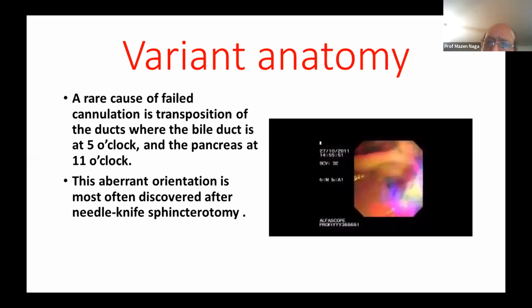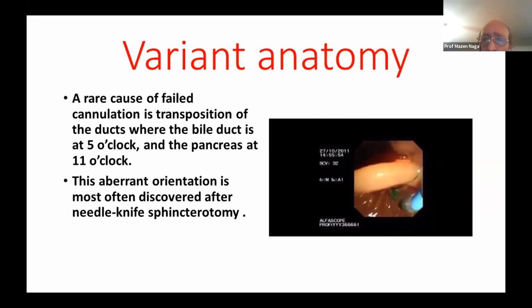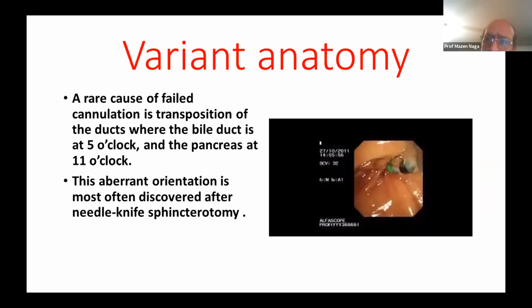We tried first with the sphincterotome with bowing and unbowing, but we failed. Then we shifted to the Soehendra 6 French dilator, trying to get into proper position, but also it was not possible. And after several tries, unfortunately, there is some deformation of the papilla with edema, making the shape of the papilla a little bit ugly. So now we shifted to use the needle knife sphincterotome.